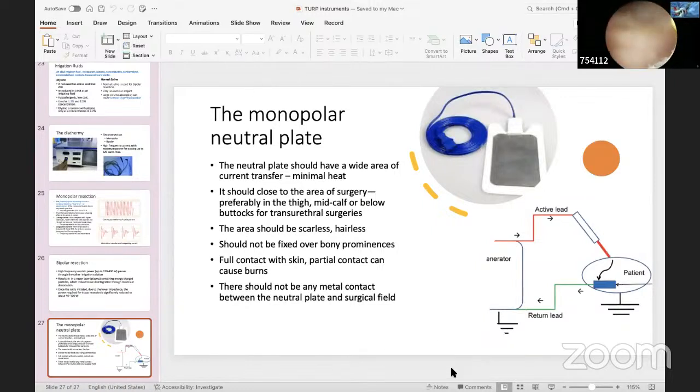Yeah, good presentation, and you have told the basics. I think any new resident or surgeon should know the nitty-gritty of these instruments, because in endoscopic surgery, instruments play a very important role. Only you have not mentioned the endovision cameras. Actually, you could have added a little bit on the camera. I could have added, yes, sir. I could have added the camera.